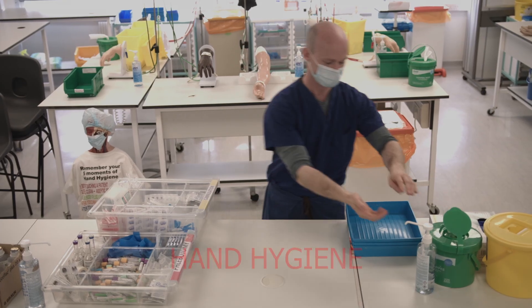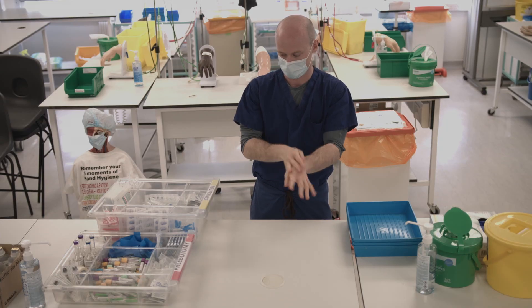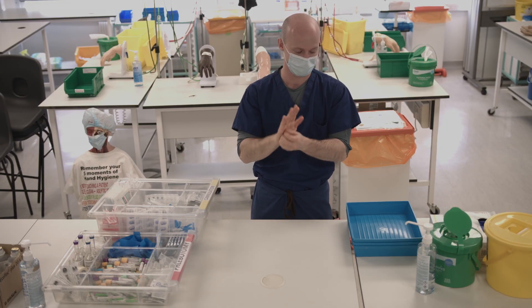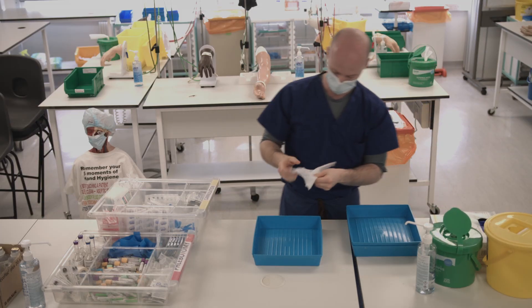Once you've prepared your infusion, you can move on to prepping your tray for cannulation and blood taking. Clean your hands thoroughly as before, and then clean your tray with a clonell wipe.